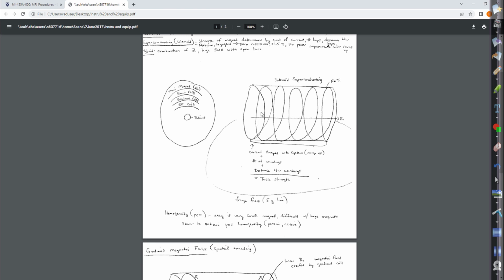The magnets that we have in the rooms, our static magnetic field is usually running horizontal, and you can see this right here is our fringe field expanding out. And I just denoted the 5 Gauss line here.